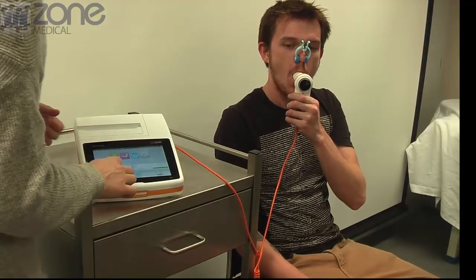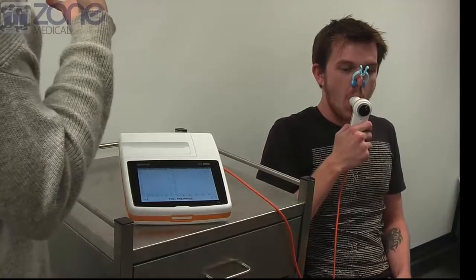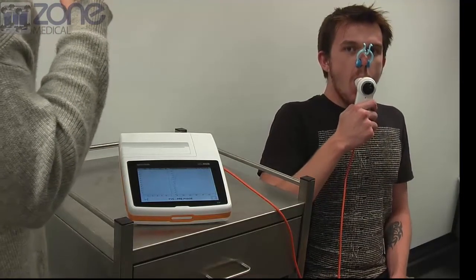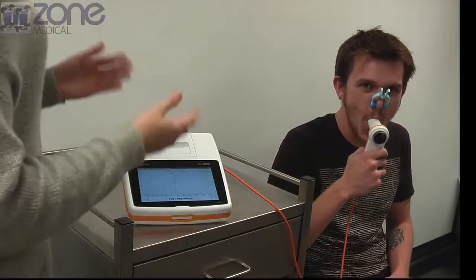Make sure the patient's mouth makes a tight seal around the turbine with no gaps. Instruct the patient to make one full inhalation at their own pace and one forceful exhalation very fast until all air is expelled.